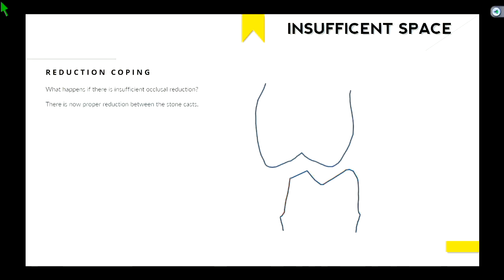So then now they'll remove that piece of acrylic. Now they can make a crown to the proper thickness because your stone to stone distance is appropriate. Remember, this is all still in the lab. So they've ground down the stone die to the appropriate thickness. Okay? So you get a crown back of proper occlusal thickness. So now your patient comes, yeah, question?